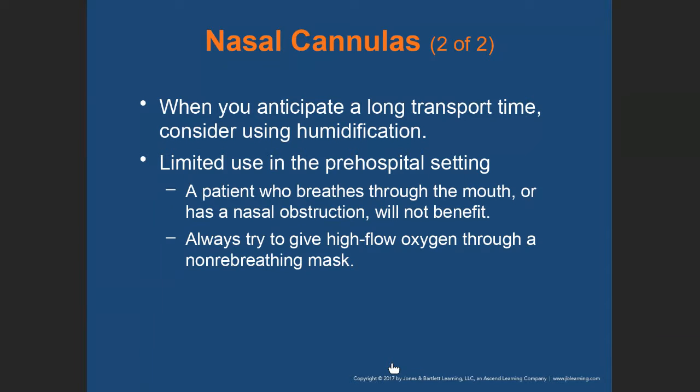Now, the humidifiers that I've worked with in the field, in the States, are one-time use. It's not for multiple patients. I do believe there are humidifiers that can be used more than once. I might not be sure, but the ones I've seen are one-time use.